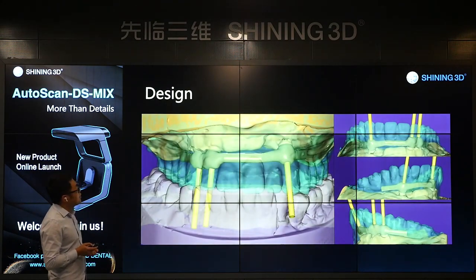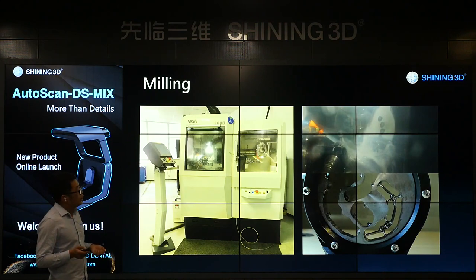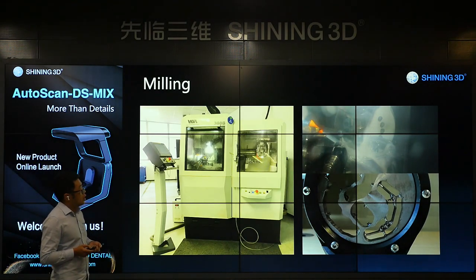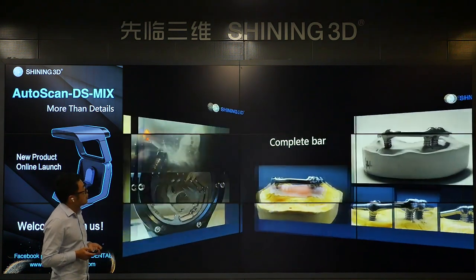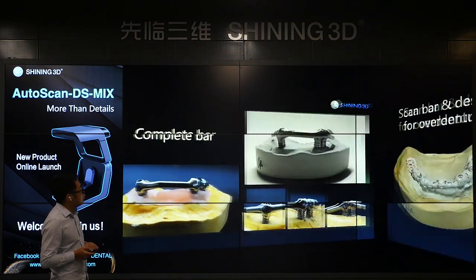So design the bar. After that, we need to mill. See, you can check the mini machine. It also can reach the industrial level, so it can avoid the deformation of the bar. After that, we need to scan. Okay, this is the bar. After that, we need to scan the bar.